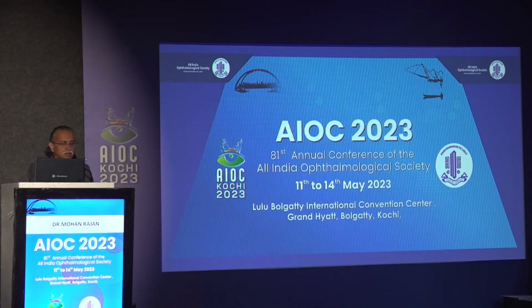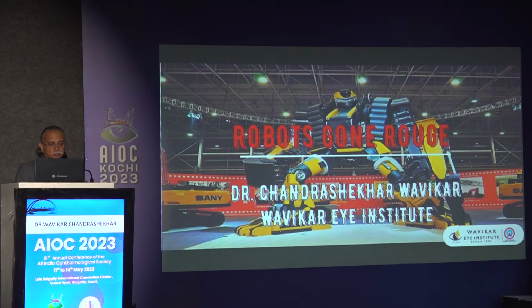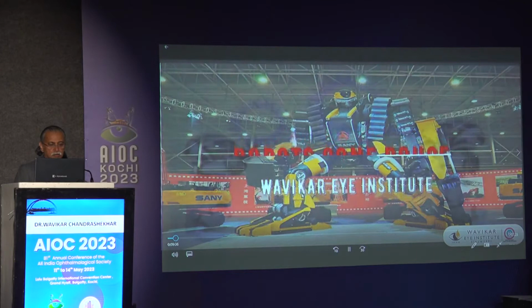Thank you, Nitin. Very nice presentations. I'm going to start with complications of FLACS. It's a video throughout, but I'll be giving the commentary.